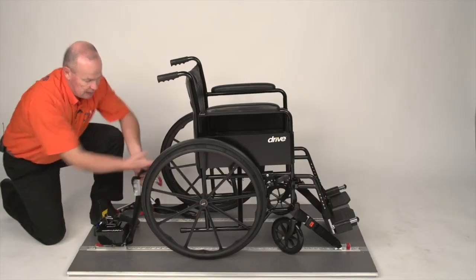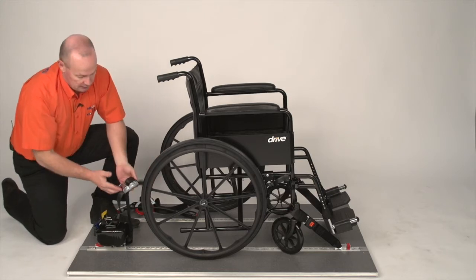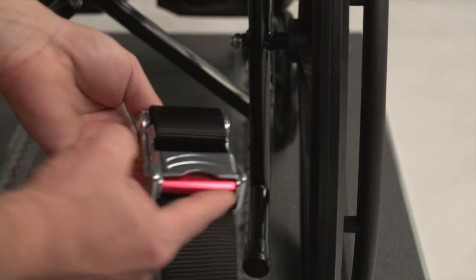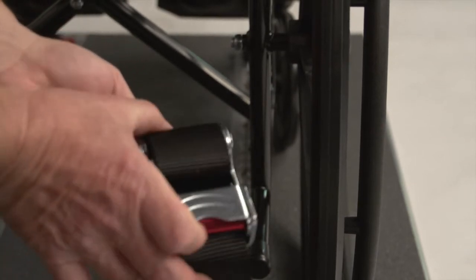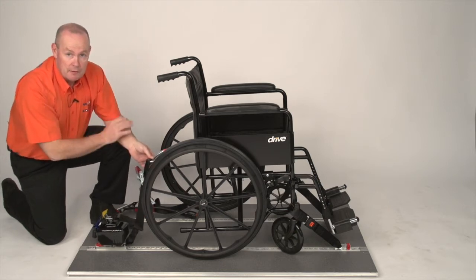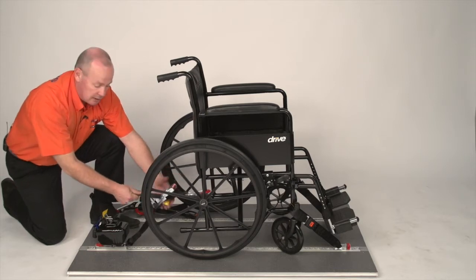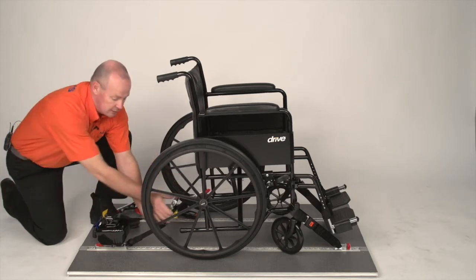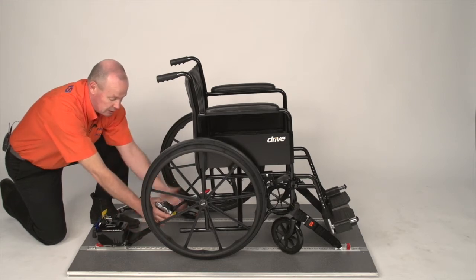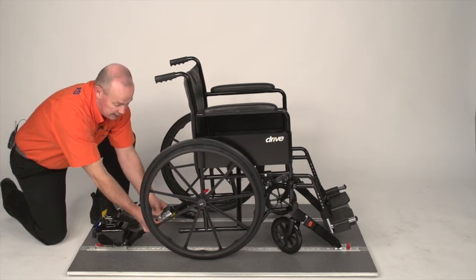We now have to attach the strap onto the mainframe of the wheelchair. In order to do the strap, we need to undo this buckle — this is called an over-centre buckle. You press the red bar upwards to release. The carabiner needs to be placed on the mainframe at a 45-degree angle. Take hold of the loose webbing, pull it down, hold it tight, and start to close the buckle. Once you've come halfway over the buckle, release the webbing and use two hands to close.